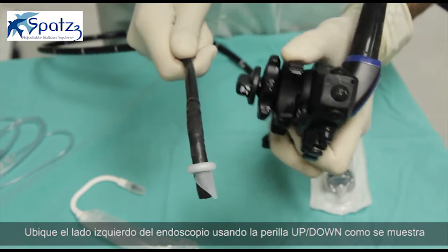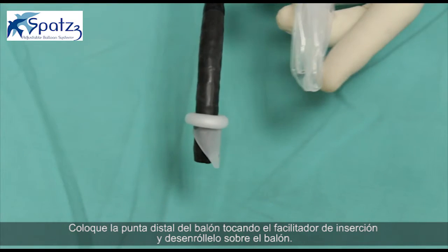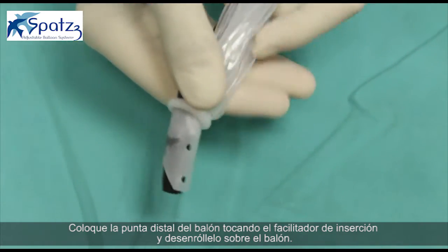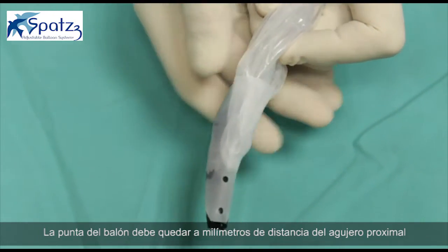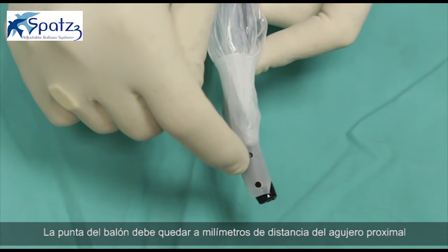Find the left side of the scope using the up-down dial as shown. Place the distal tip of the balloon just touching the insertion facilitator and roll it over the balloon. The balloon tip should be within millimeters of the proximal hole.